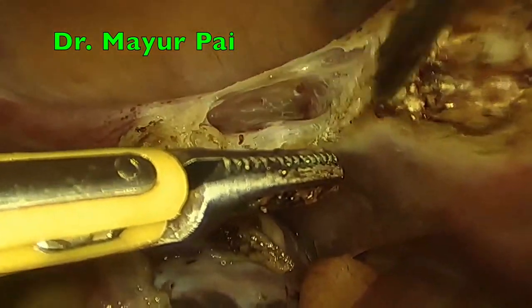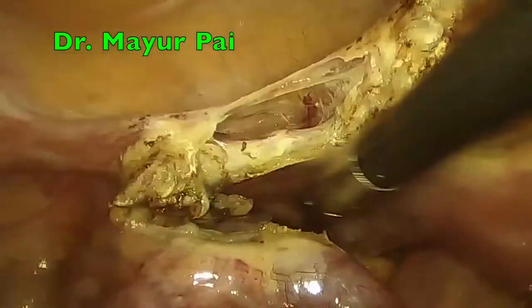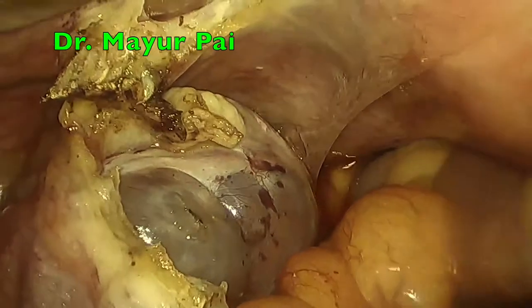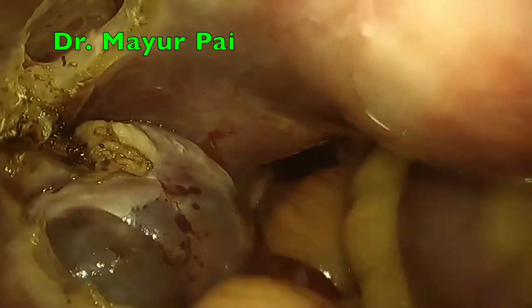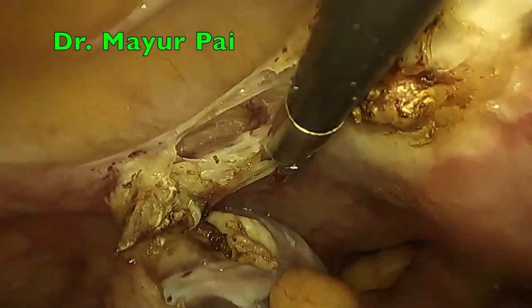The uterus is a normal to bulky size, not very large, and it's a fairly easy case that I can show you. We are getting the adnexal mass to the side, which helps us in better visualization of the structures. Small flimsy adhesions that we are finding there can be easily dealt with just by blunt traction.